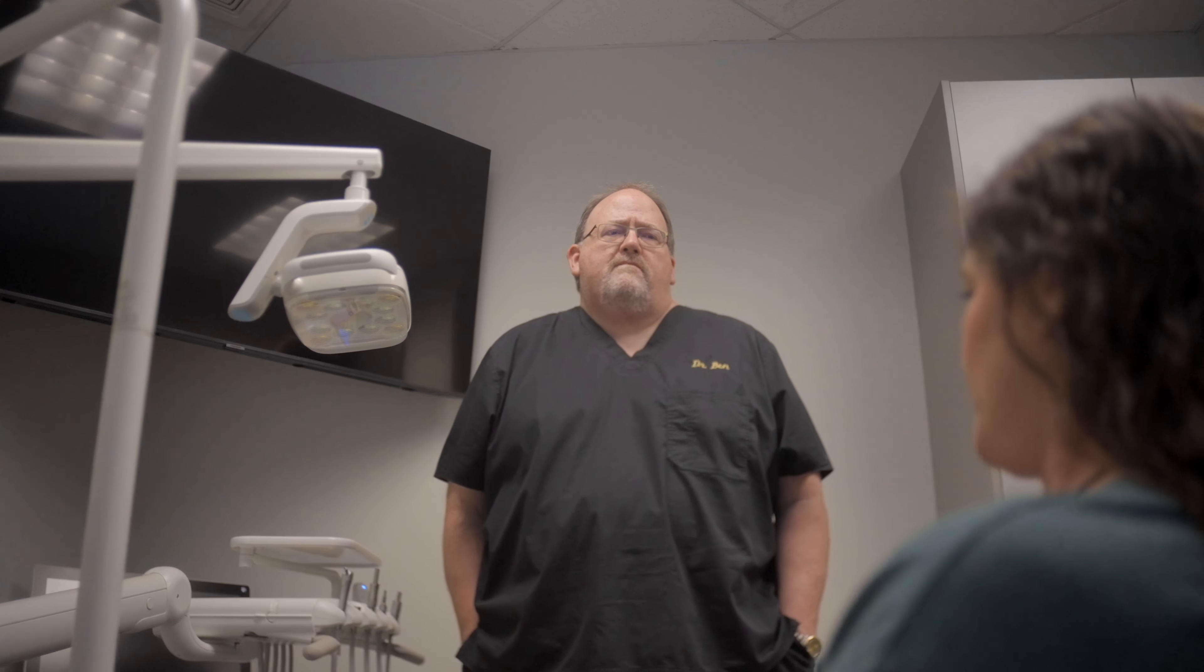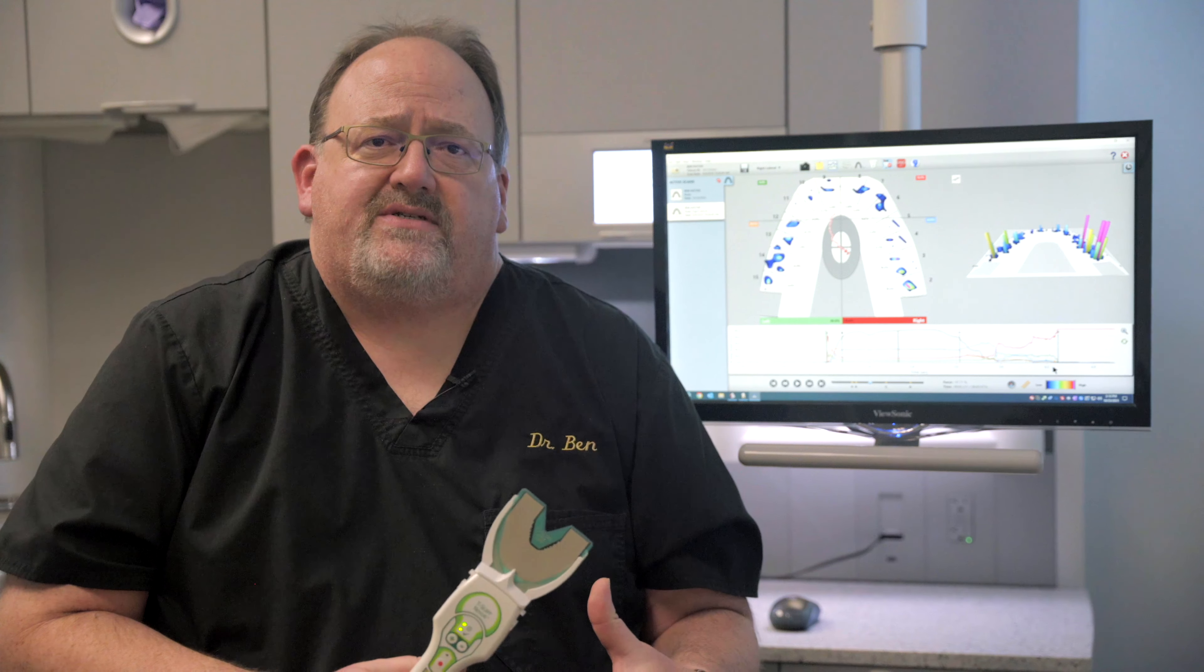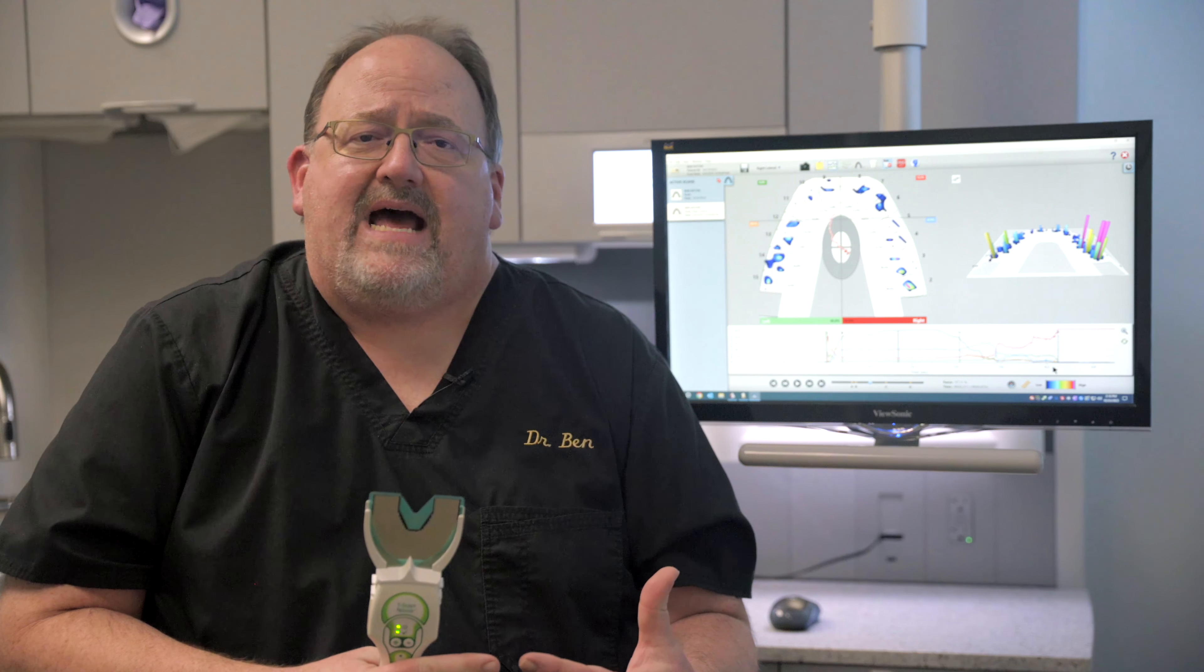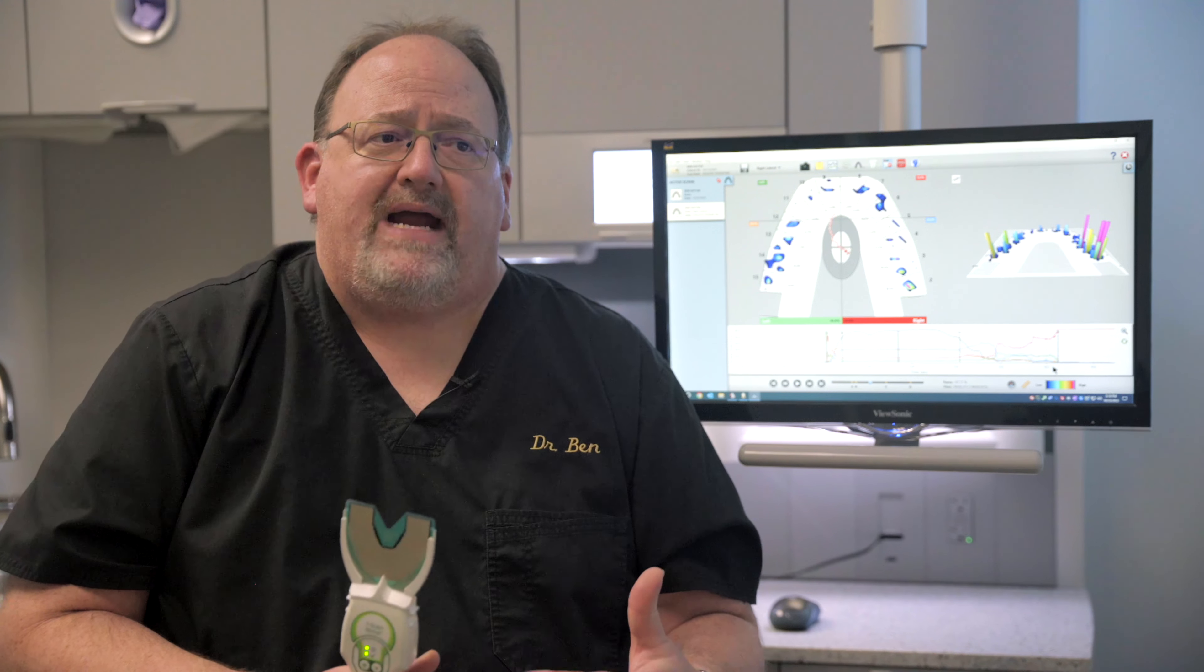This is really important. If you have an implant done or you have a crown done or you have a filling done and they use that bite paper, that's only 13% accurate. It sets doctors and patients kind of at opposition where patients are going back multiple times to have their bite corrected. And sometimes that works and sometimes it doesn't.